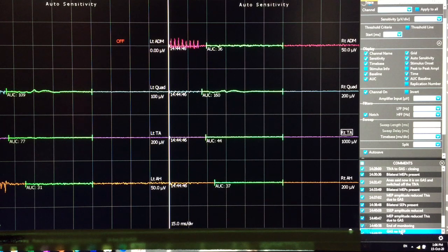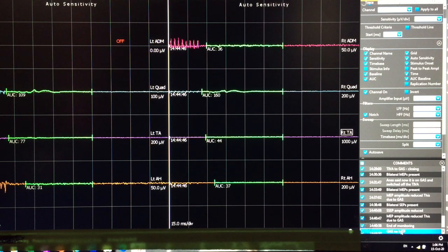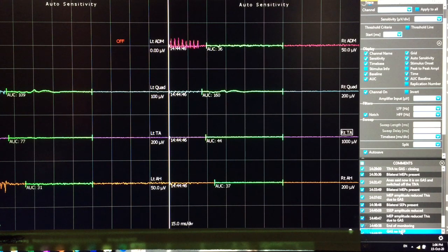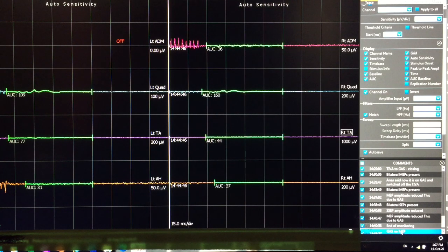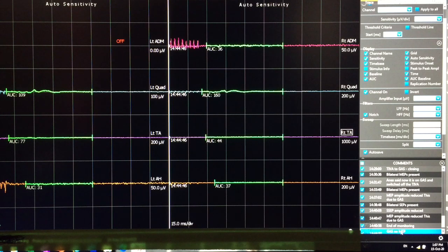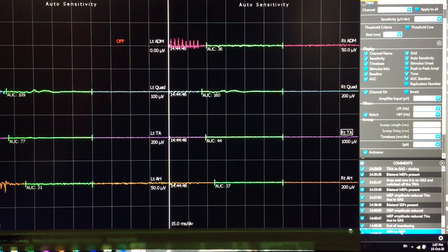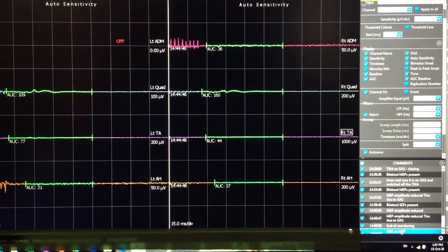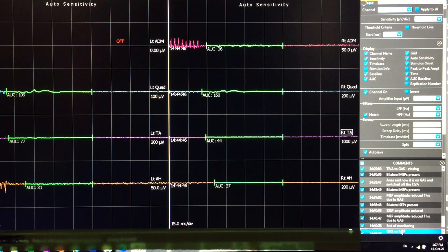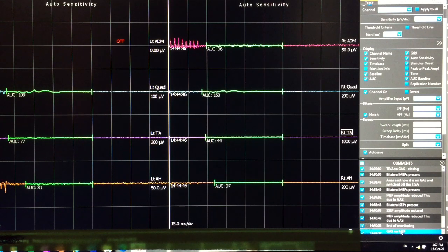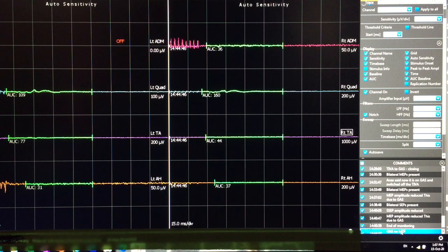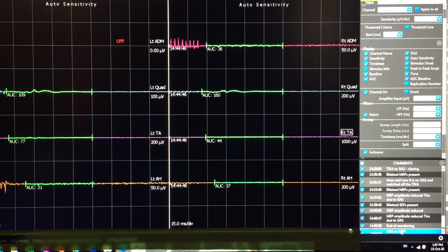The first changes we started noticed at five minutes, slight reduction in the amplitude, and 10 minutes further reduction in the amplitude, and the final one after 15 minutes, that is completely flat. So it takes 15 minutes to see the complete changes.